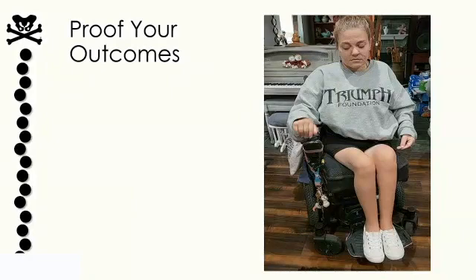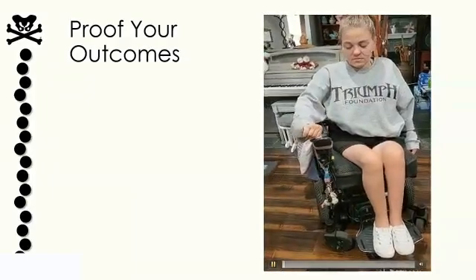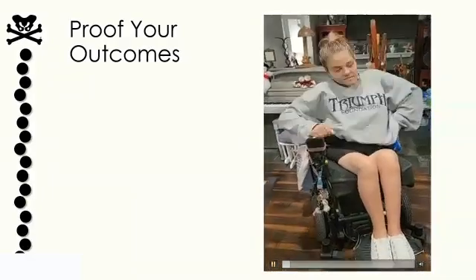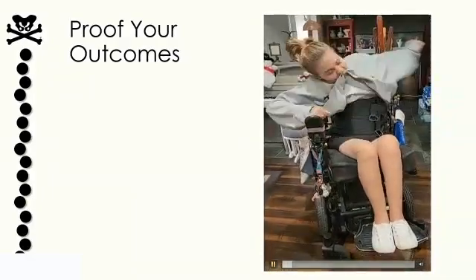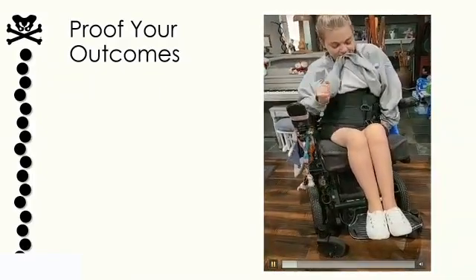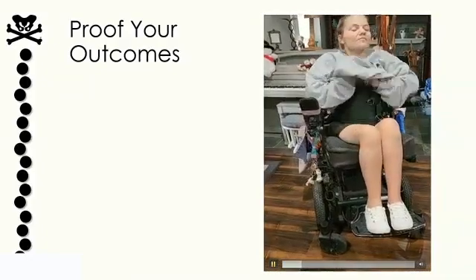So you'll see her go through these 3 segments really quick. I'm going to start the video and I'll describe as we go along. Again, she's going to first position herself at rest. We are going to try to get a restful alignment that feels the best for her, where she can relax and breathe and rest.